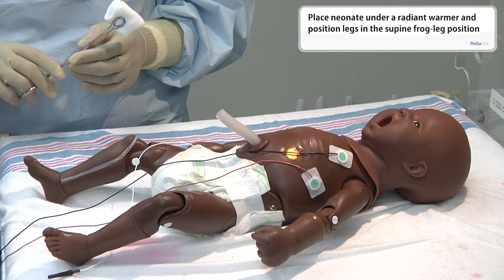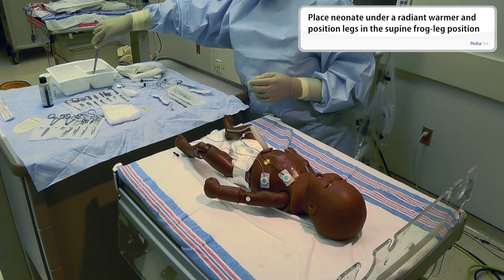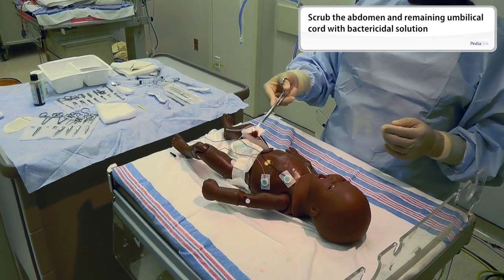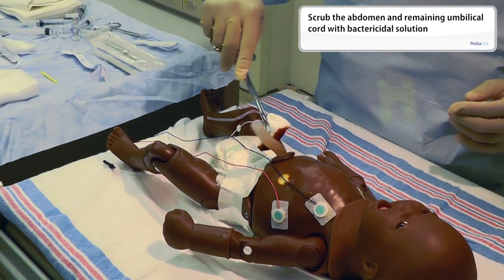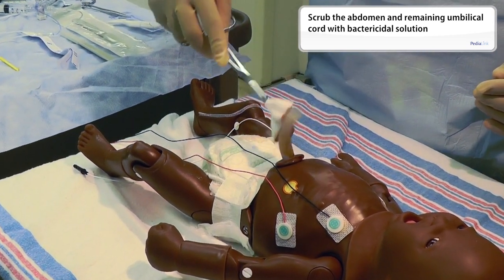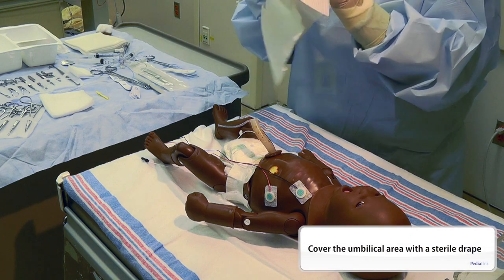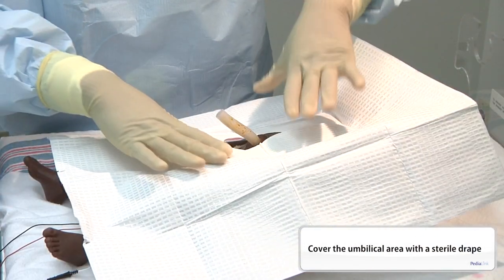The infant should be positioned in a supine frog leg position. Restrain the limbs if necessary. Next, scrub the neonate's abdomen and remaining umbilical cord with a bactericidal solution. Assure that you prep from the xiphoid process to the pubic symphysis. This should be done 3 times. In this example, a sterile fenestrated drape is then placed over the umbilical area.